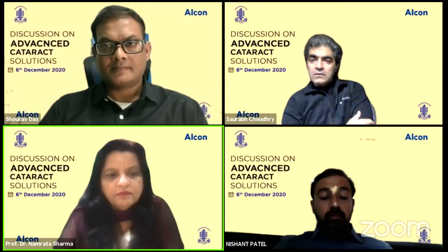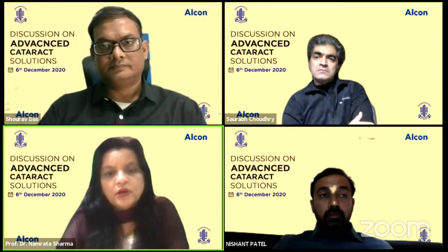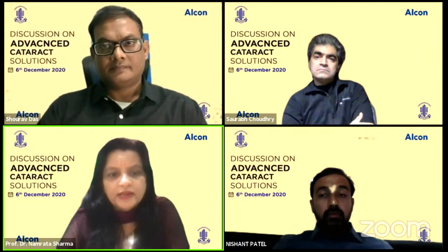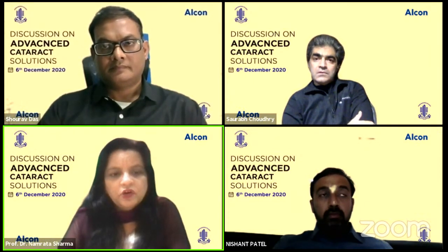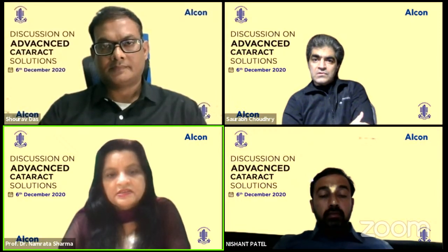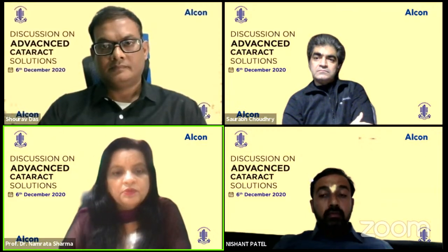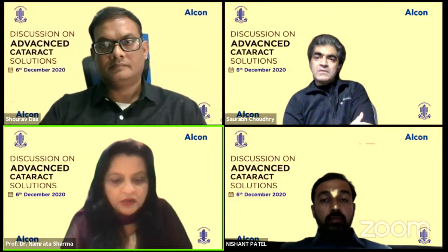We have both the systems, from Zeiss as well as from Alcon, the 3D systems, and I think they were the first ones to come up with the 3D system, and it works well. It is very useful, especially for your ancillary staff who are assisting you, the anesthetist, the nursing staff, because they know what you are actually doing, and whenever there is a problem or a complication, they can witness it and help you accordingly, as per the step required.